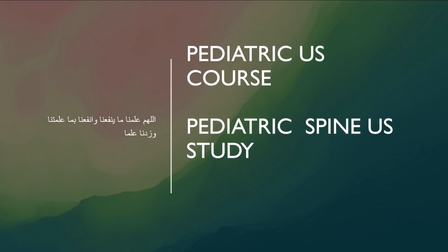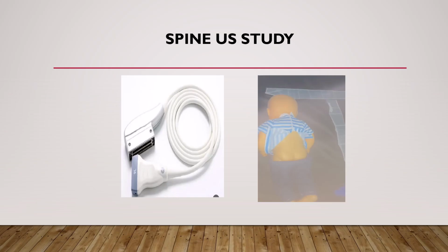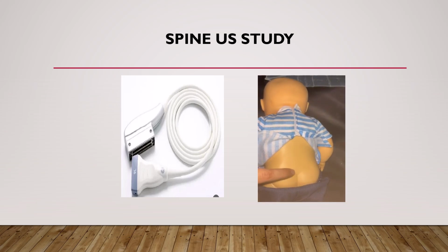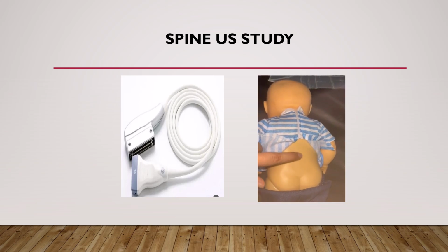Today we will continue the pediatric ultrasound course and talk about the spine study. As you see, this is the probe we use in this exam. This is a 9 linear probe, and there is a mild explanation of how we can do this exam. This is a baby. We will expose his back and begin from down upward.